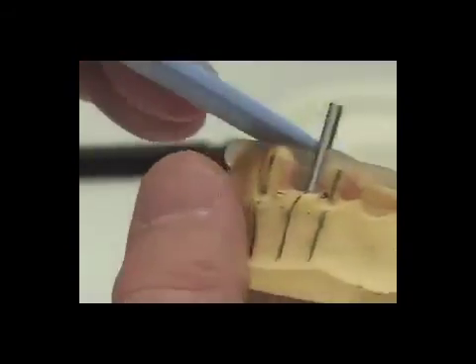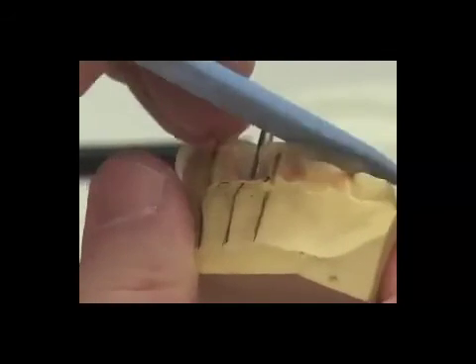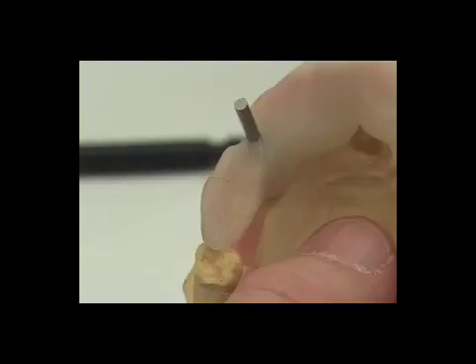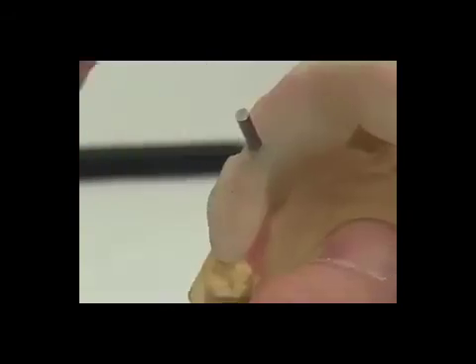Remembering that the height of the surgical guide wants to be not very much taller than the occlusal surfaces of the teeth, we have good adaptation going from one to two teeth beyond the edentulous area to at least the bicuspids of the opposite side.